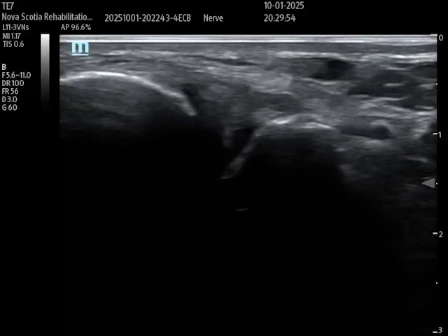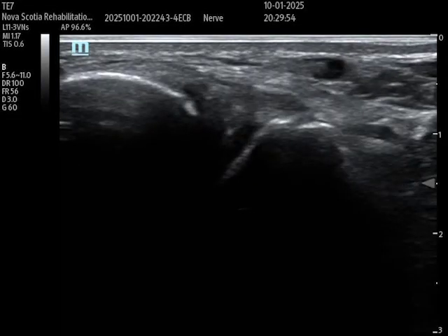What I've done now with the probe is translate from anterior to laterally, such that on the left of the screen we have the bony landmark of the lateral malleolus, and on the right, the talus. You could also do a lateral approach and inject into the joint space here. Depending on patient positioning and underlying conditions, it might be better to access laterally versus medially — there are many techniques.